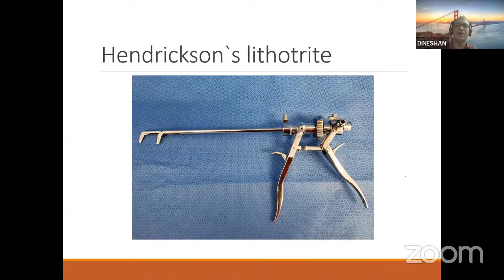Another thing is Hendrickson's lithotrite. This is vestigial. With the introduction of laser and other stone punch, I don't think anybody uses it, but at times you may get to see this in any of the exams. It's a crude and heavy instrument.